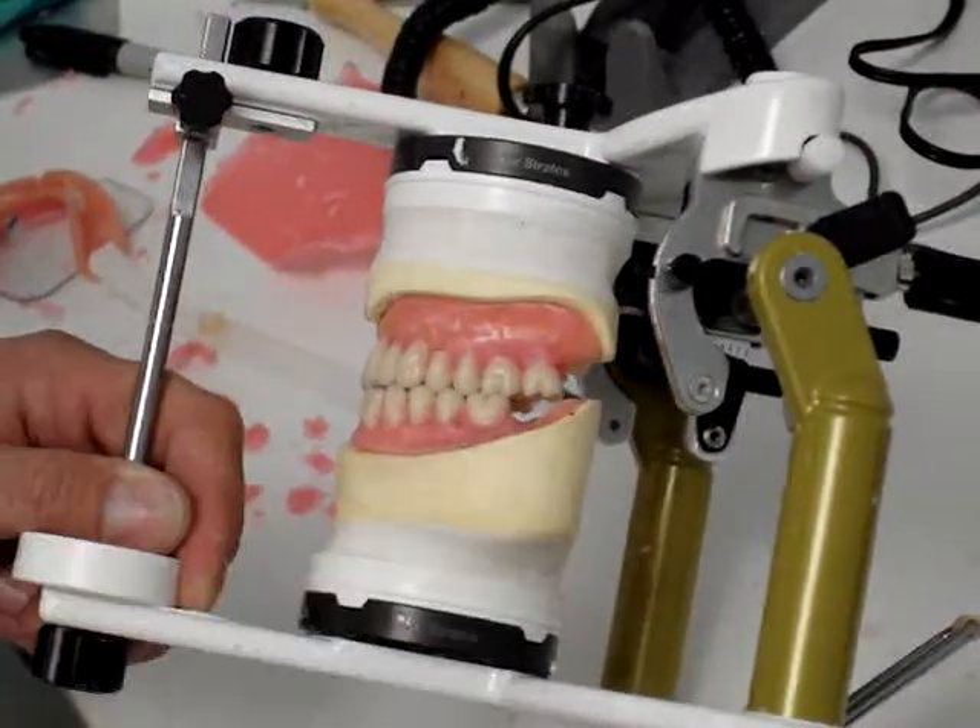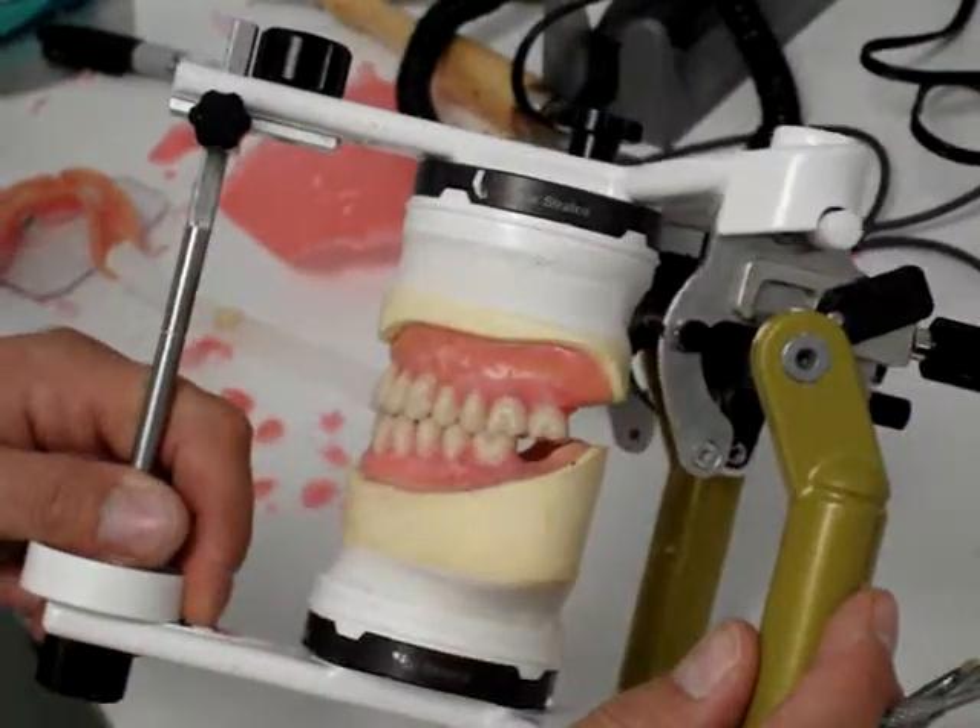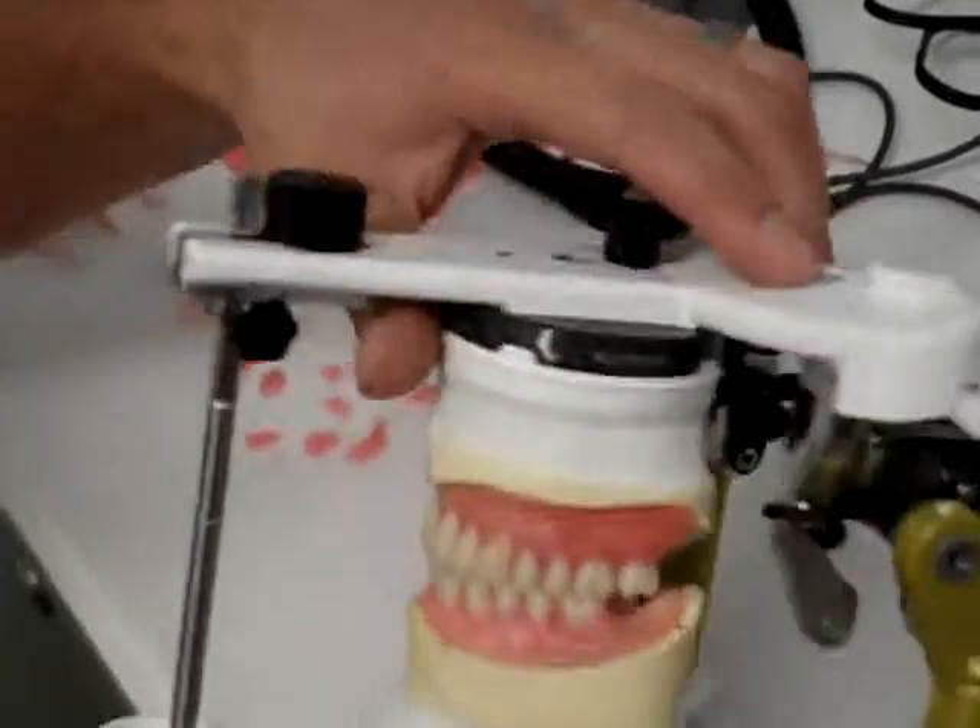I'm going to loop this down and then do the same to the other side, and then just double-check things after we finish with that.